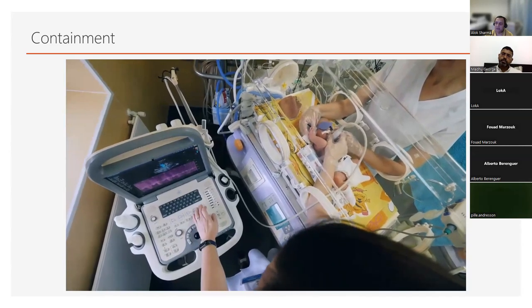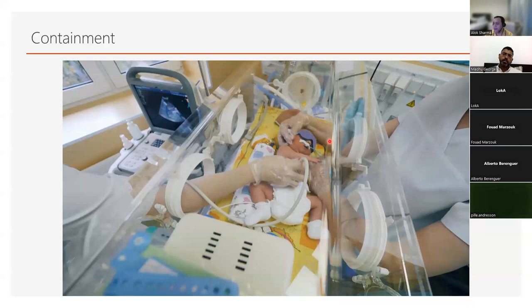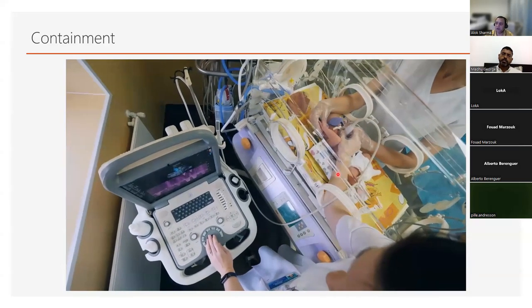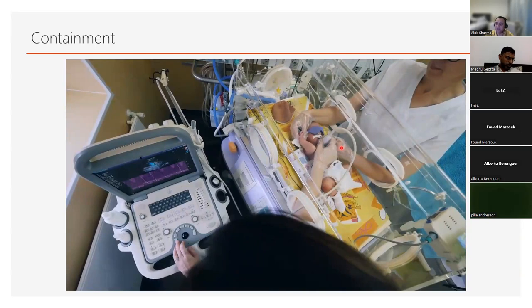So again, scanning the anterior and the lateral region would really involve you having to try and lift this arm. You need to lift it. It needs to be abducted. Otherwise, you're not going to be able to get into the right upper axilla to do R1, R2. I cannot emphasize this enough.